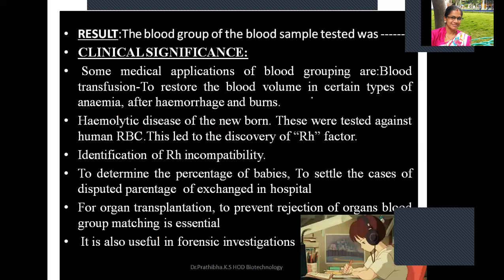Okay, now coming to the result. The blood group of the blood sample tested is whatever blood group you got, whether A positive, B positive, AB positive, whatever the experimental blood sample you got, that you need to write here.